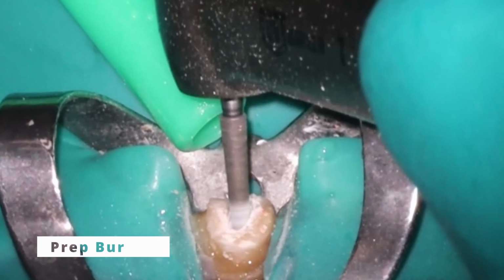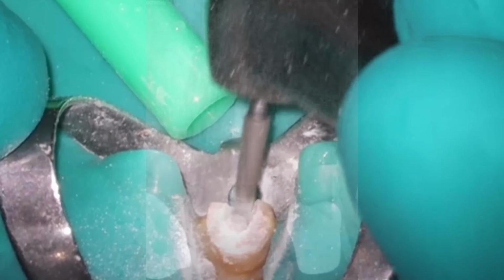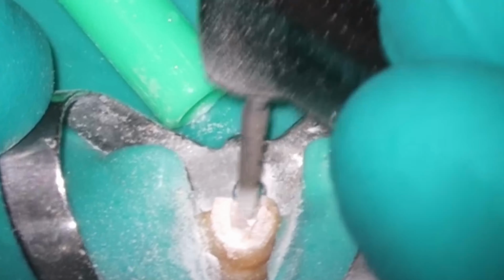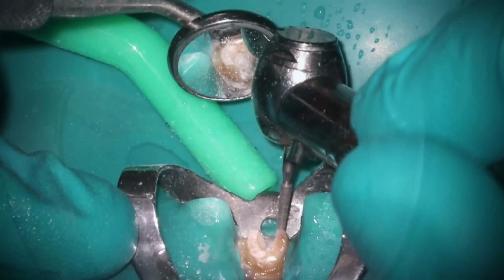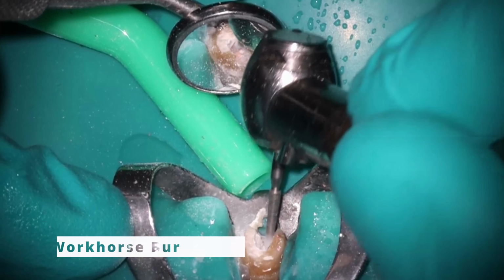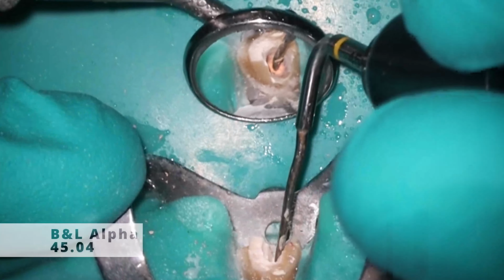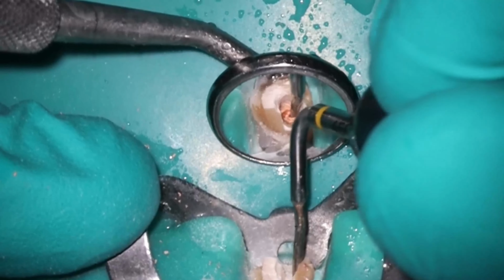I'm using the prep burr here because the access was pretty large to begin with, and it was just that little smush of composite in there, as you saw from the x-ray. So I'm going a little bit more aggressive because it was a large chunk of composite, and I like removing composite with this big prep burr. It just makes it so much easier. After that, I use the workhorse burr just to clean up a little bit more, and we've exposed the gutta percha at this point. So we're going to start the retreatment process like you normally have seen me do, using the alpha here to remove that gutta percha.